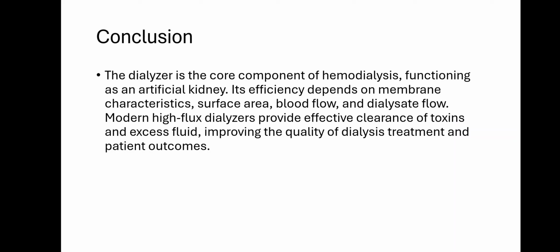The efficiency of the core component of hemodialysis depends on the membrane, improving the quality of dialysis treatment and patient outcomes. We can choose the dialyzer as an artificial kidney. So, we know that the dialyzer is a core component of hemodialysis.